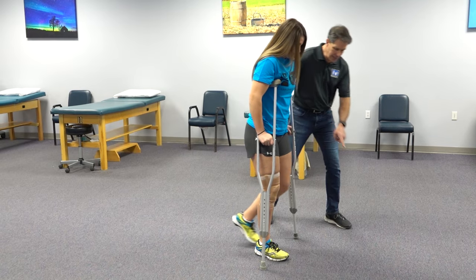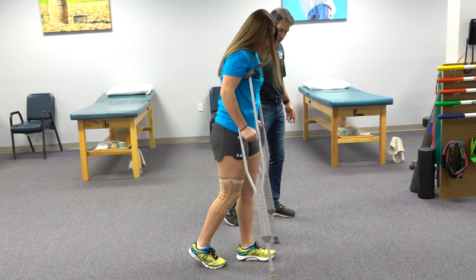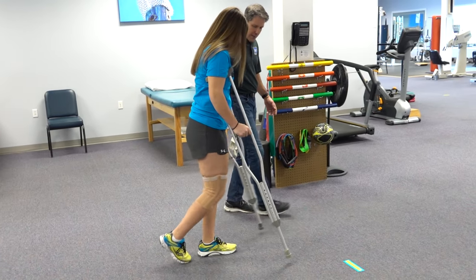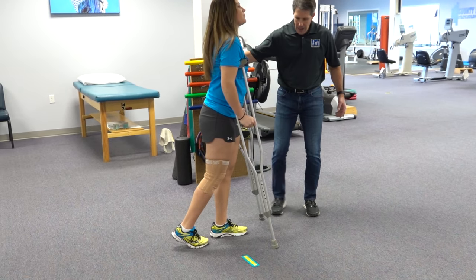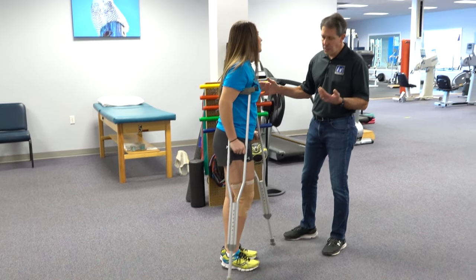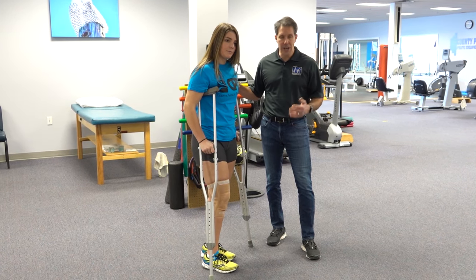So crutches and the bad leg — the left one will come through. And that is a step-through gait, and that is partial weight bearing. That is how we do this when you are instructed to go partial weight bearing or just toe touch weight bearing.